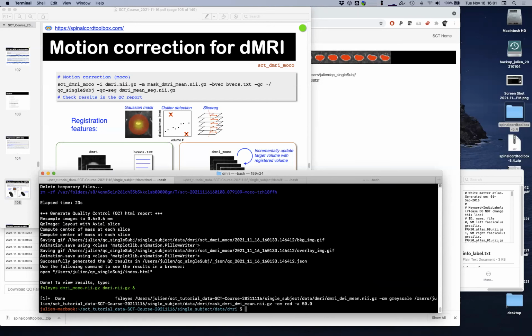So it's basically TX and TY, but the TX and TY is different across the different slices. And the parameters. I'm sorry. Yeah, no, I have a mindset on brain imaging. So maybe my question is, do you have the eddy current distortions also in this type of images you may want to correct?